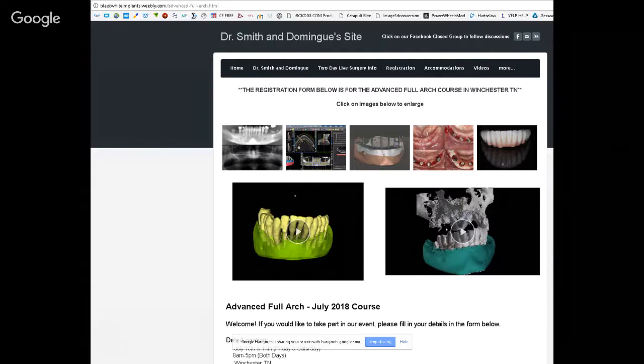What I do is I'll torque in my custom abutments. I'll seal off the abutments with Teflon and flowable composite. I'll fill the area with Fuji cement that is radiopaque. I'll fully cement it on all my abutments at the same time, and the excess cement comes out through all those screw access holes. Then I seal off those access holes with composite, and that's how the patient leaves.